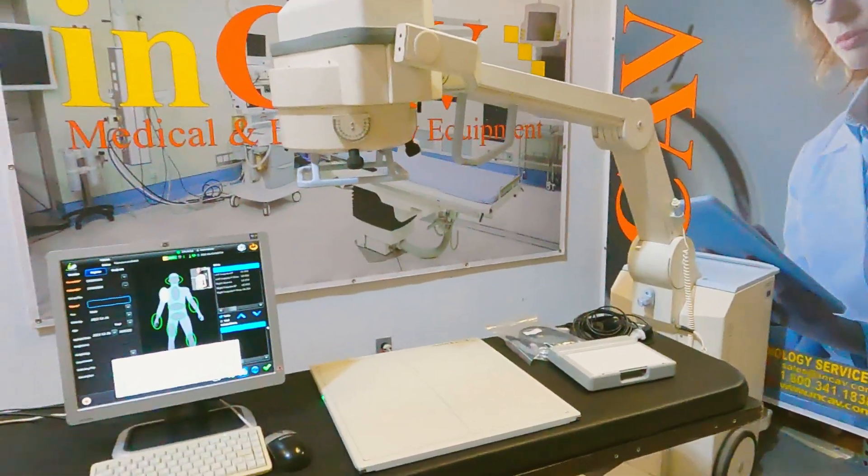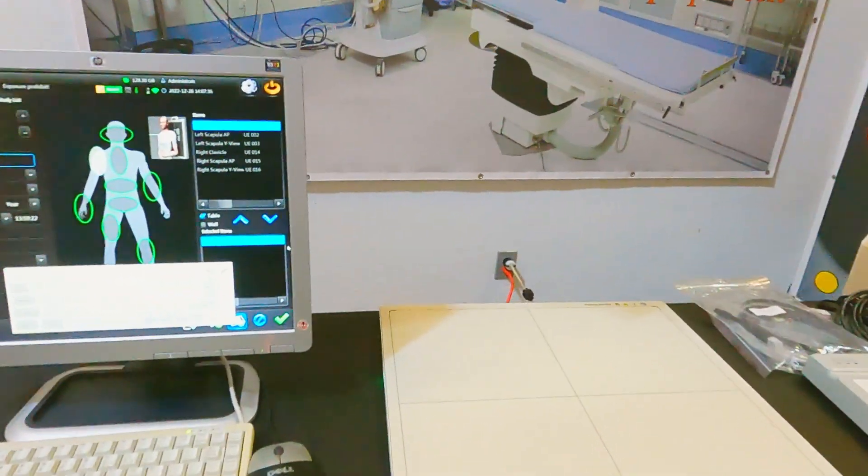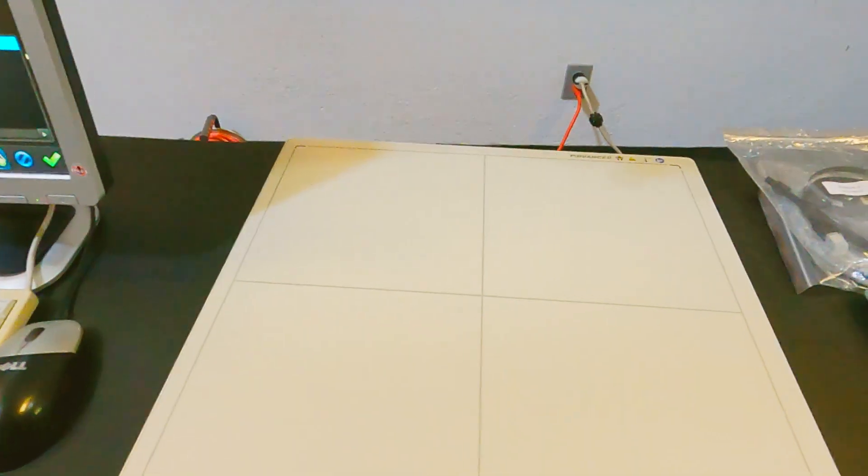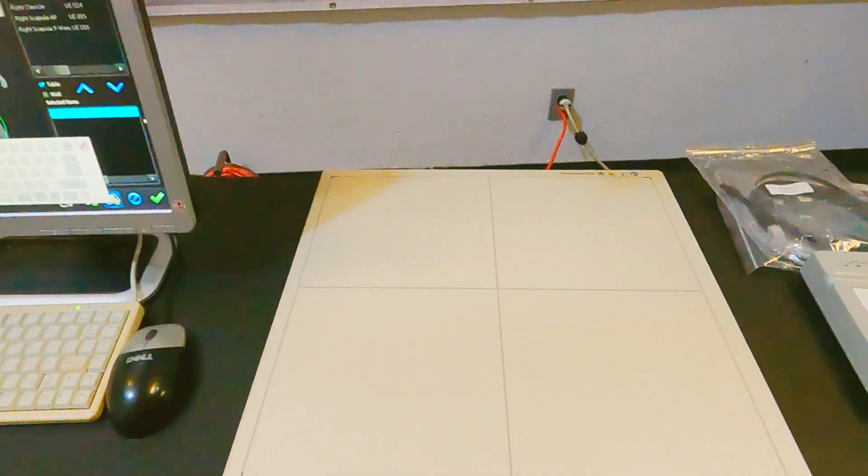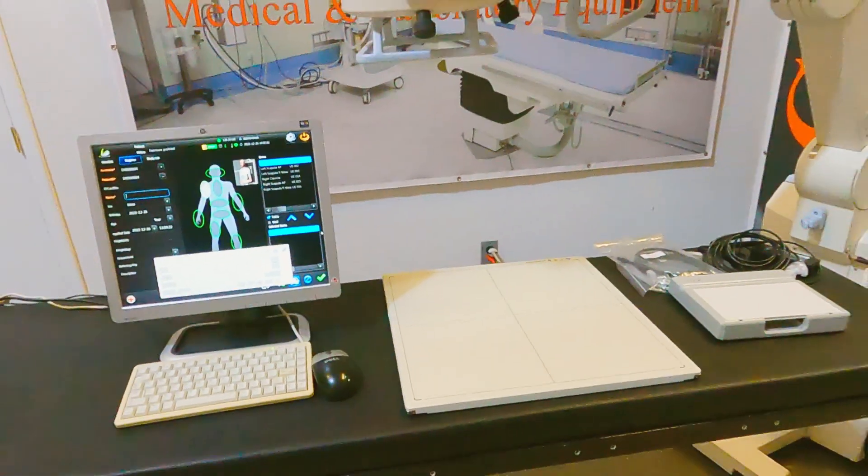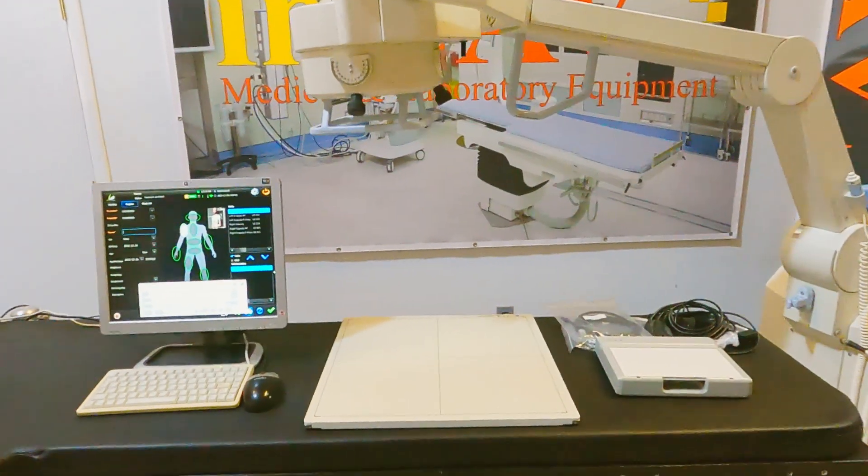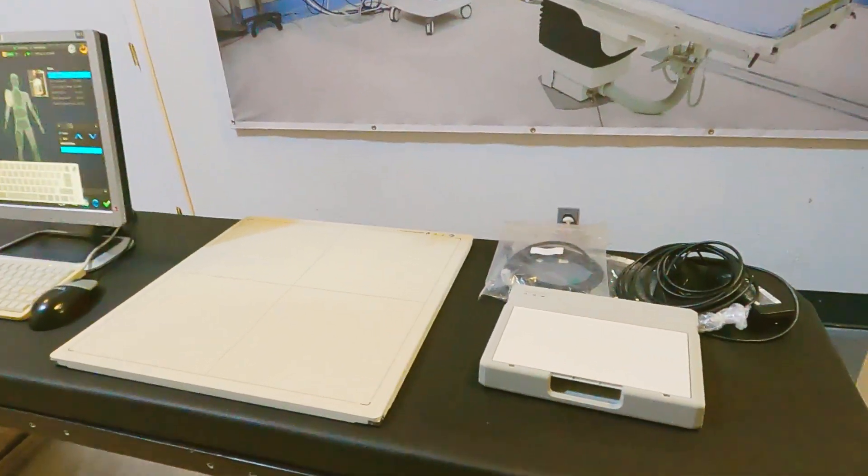Welcome to InCAD Medical, your best option for medical equipment. Today we are going to see the advanced 17x17 DR wireless digital flat panel detector with the I-Ray workstation.